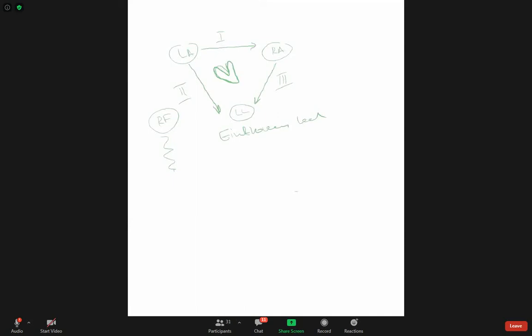احنا ايش قلنا؟ طلع شيء اسمه hexaxial. فعندنا lead 1 هنا. قلنا lead 2 يجي شكلها زي كذا. عندنا هذا هنا AVF. هنا lead 3. اوكي. وعندنا هنا AVL. عندنا وش كان باقي هنا AVR.